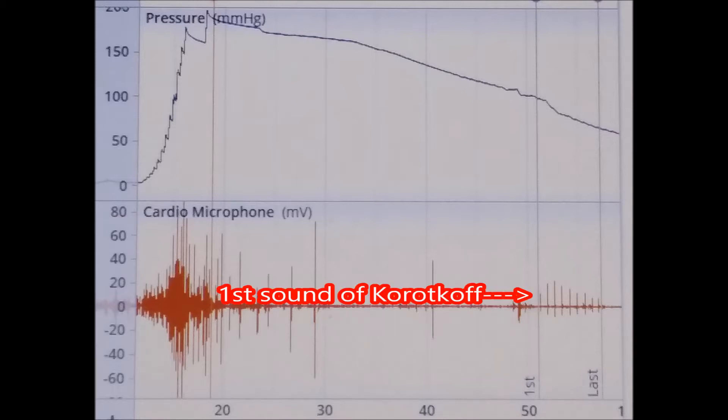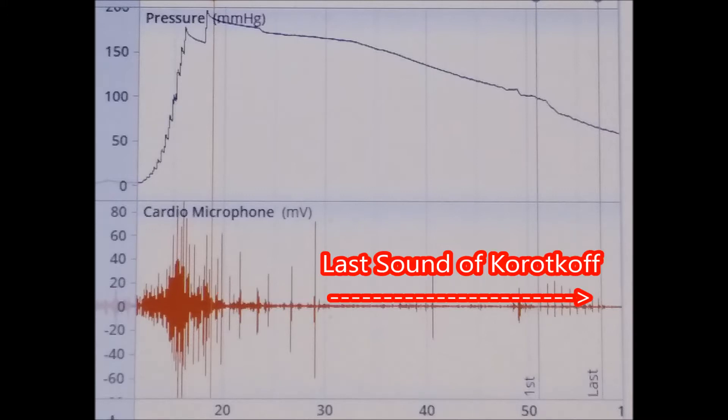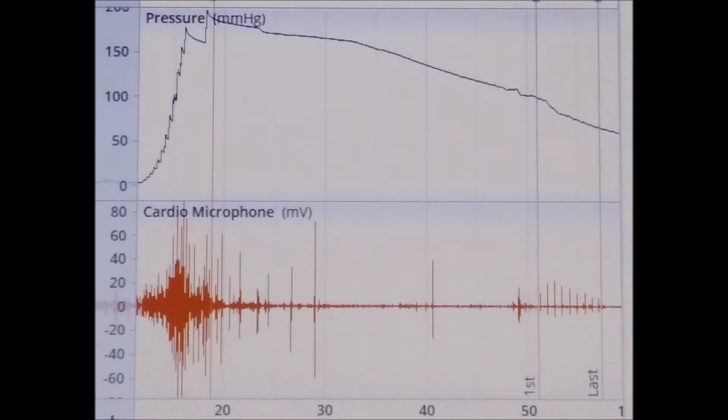The first sound of Korotkoff begins to appear when the blood pressure in the cuff matches that of the patient's systolic pressure. The last sound of Korotkoff is heard when the patient's diastolic pressure matches that of the pressure in the cuff. After which, the cardio microphone ceases to pick up any sound.